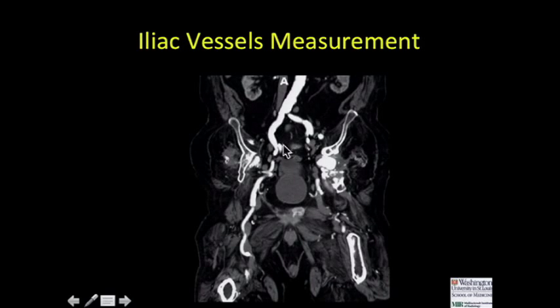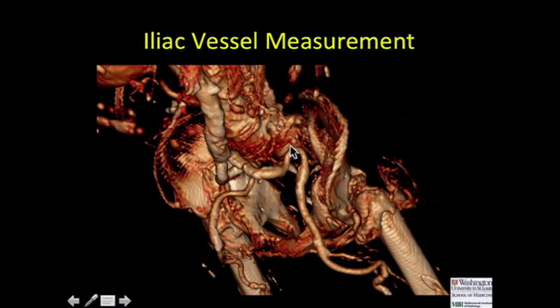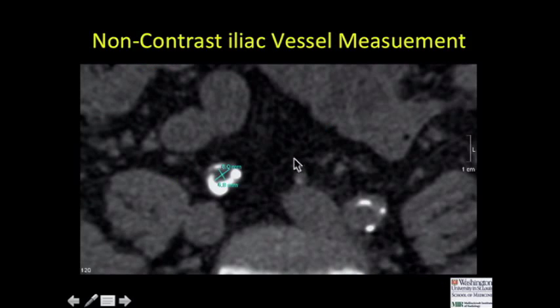If you have a very tortuous configuration of the iliac vessels, you may not be able to generate a curved MPR — because the vessel is curling back on itself. A 3D representation in such a patient may show the external iliac doing essentially a U-turn — coming down, doing a 90-degree turn, then another 90-degree turn back upon itself — which with calcium would not be ideal for a femoral vascular approach. Similarly on non-contrast studies, measuring from calcium to calcium, a narrow point of about 5 millimeters makes it unfavorable for a right femoral vascular approach.